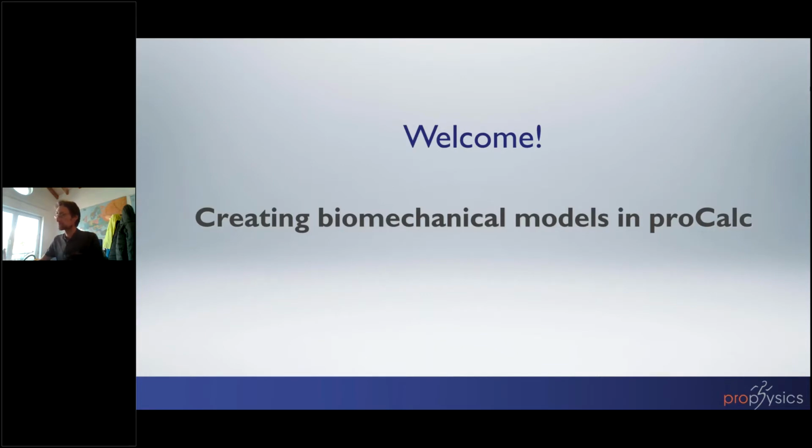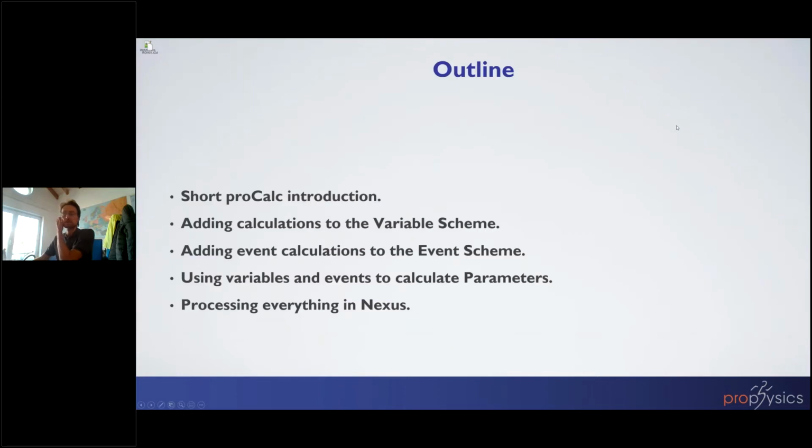So my first job is to switch to the next slide. So this is essentially what we're planning to do. A short ProCalc introduction, just telling you a little bit about what it is. I hope and think that most of you have come across it or heard about it at least before. Then we're going to add some calculations to the variable scheme.